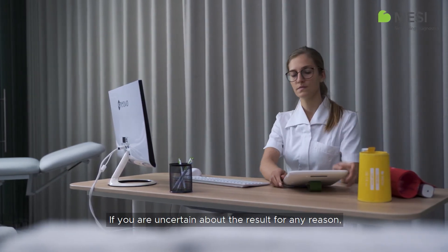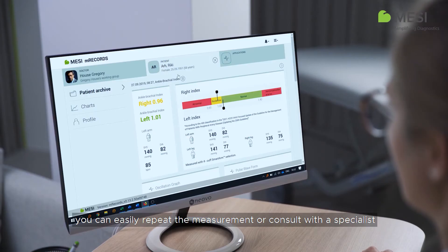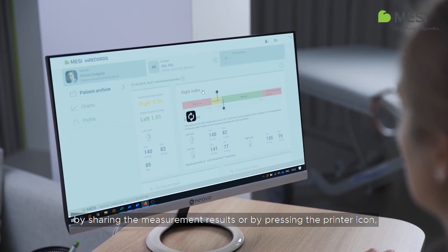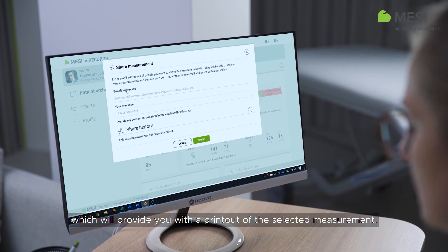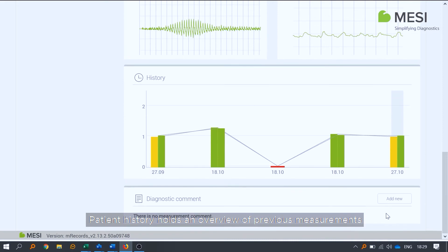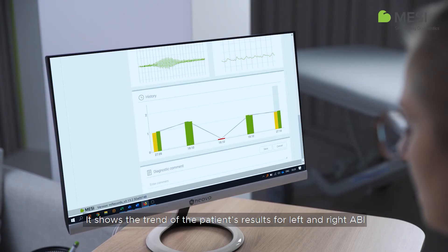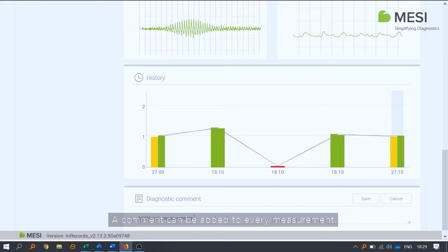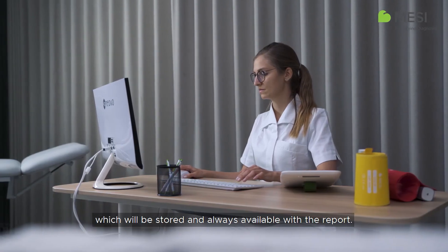If you are uncertain about the result for any reason, you can easily repeat the measurement or consult with a specialist by sharing the measurement results, or by pressing the printer icon, which will provide you with a printout of the selected measurement. Patient history holds an overview of previous measurements taken on the same patient. It shows the trend of the patient's results for left and right ABI on a specific date. A comment can be added to every measurement, which will be stored and always available with the report.